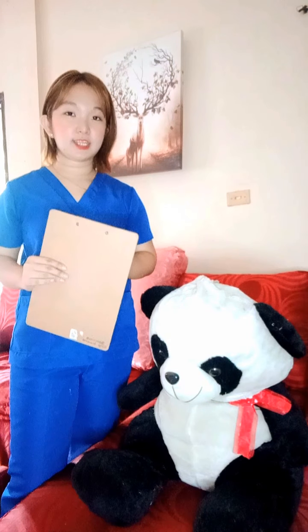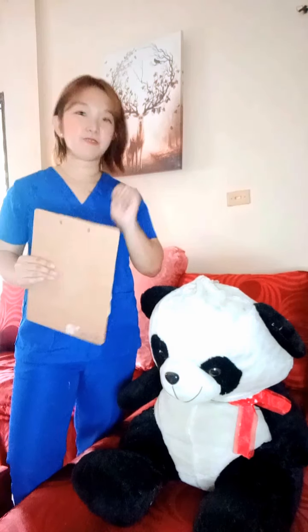Lastly, check for the client's ability and willingness to cooperate. Since we encounter some clients or patients who are unwilling to take medication, always try some ways and alternatives just to get the medication to the patient. The second step in preparation is to determine the size of the muscle of the patient. Since our injection is called intramuscular, the patient may vary: infant, child, and adult. So the muscular structure of the patient may also vary. It is a must and important.